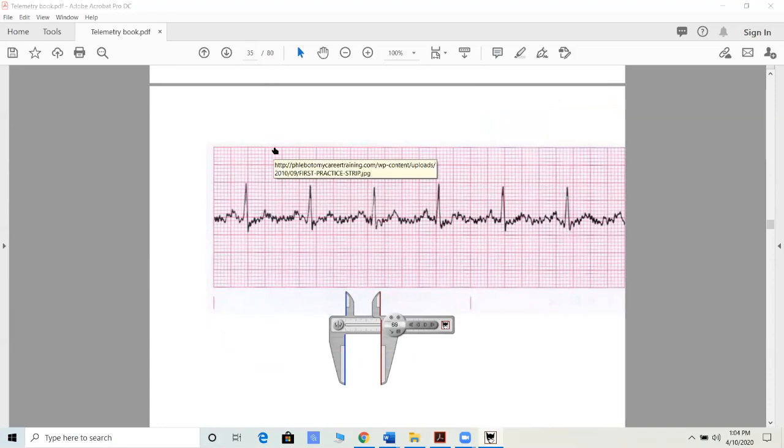First of all, what can we identify? We can see an R wave, we can see an R peak. But anything other than that, we really can't discern, because if there is a P wave, it's somewhere buried in all of this. It looks like somebody just scribbled in between each of the R peaks. So if there's something that we can measure, let's measure it. What we're measuring right now is our ventricular heart rate.